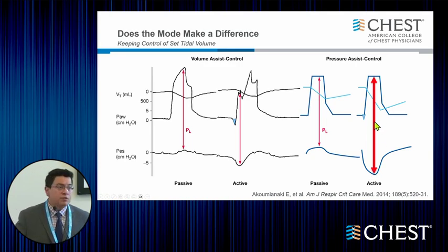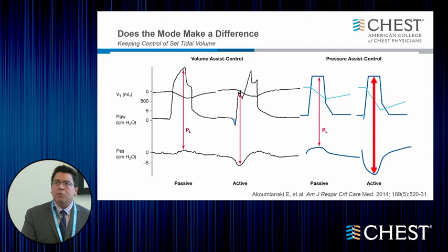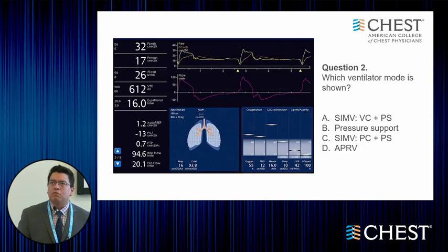This could be injurious or not, depending on the amount of volume we have. So I feel that volume and pressure control, and this is what this evidence-based piece points towards, the pulmonary mechanic tracking can actually be better exerted by critical care teams under volume control versus pressure control. But really, benefit in outcomes is difficult to follow.